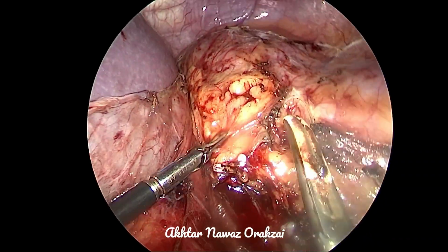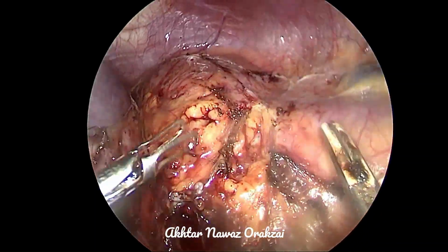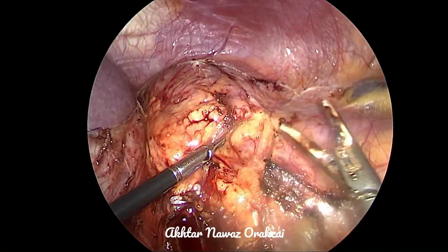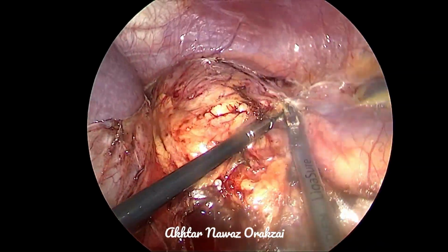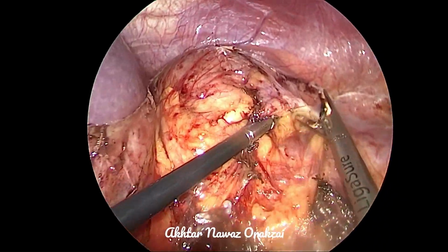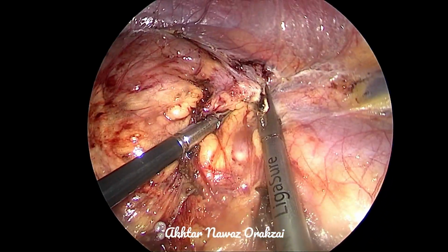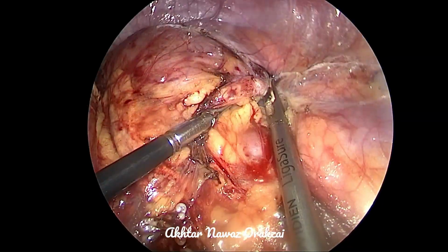This step is extremely important. We are doing a horizontal dissection, and we are not going deep into this tissue, because going deep, there are two chances. One, we can injure the small vessels which are exchanging between the Gerota, the upper pole, with the adrenal gland.